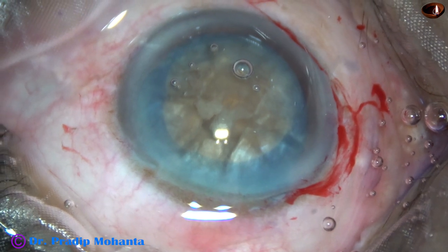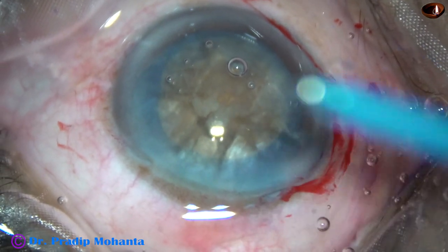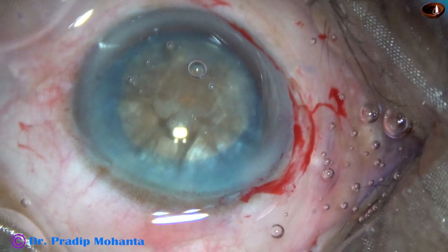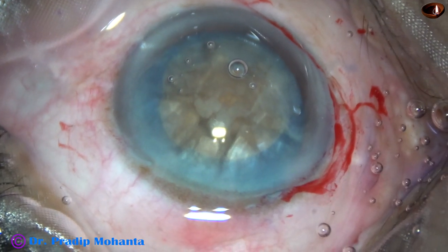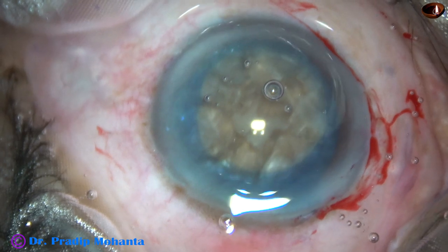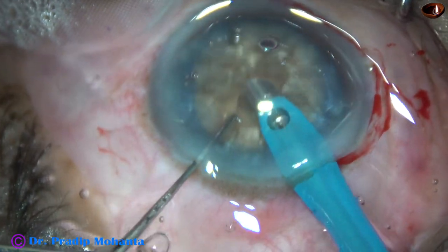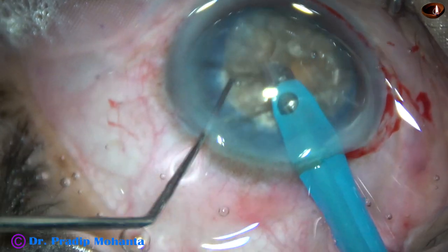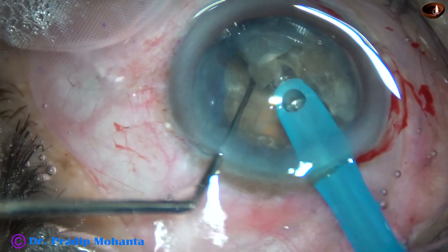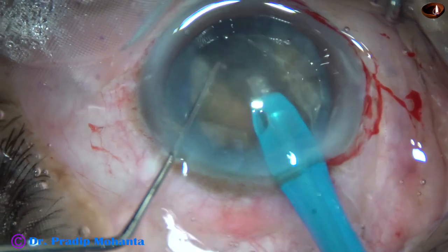Friends, this is a very long video. I didn't want to edit this video much because it has taken half an hour for me, and if I reduce this video to about ten minutes, you will not understand the struggle that I went through. Everyone has to go through struggles to do a nice job. Now I go again and am going to emulsify this piece. I have got it free — now it is a free nuclear piece. I am going to emulsify this piece.